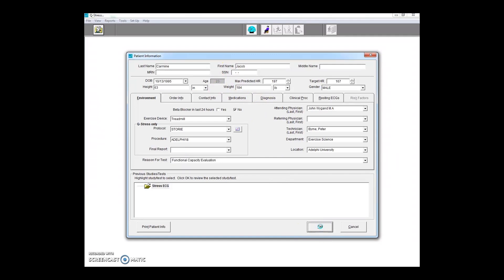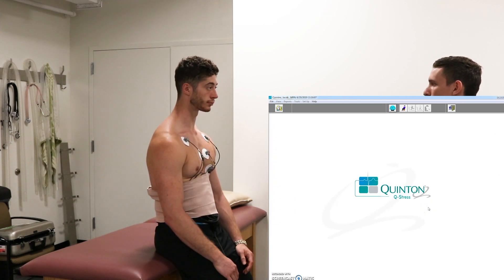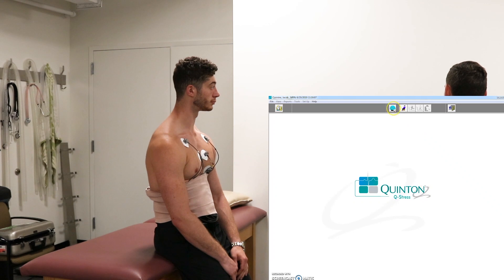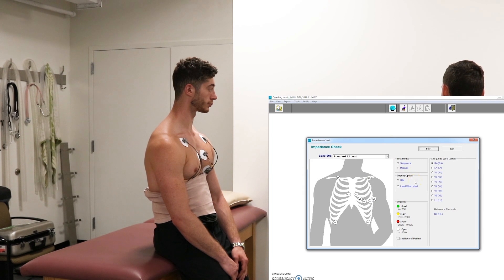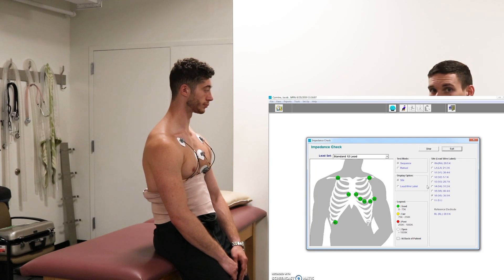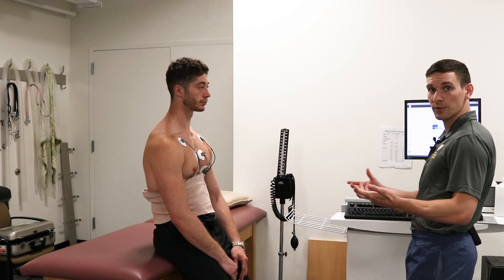We come back to our subject, have them lean up against the bed and stand normally. We run an impedance check — clicking the button for the person standing with all the electrodes on. If we did a proper prep and placement, all leads should come up green. We hit Start, wait for all of them to pop up — and they're all green, meaning everything's been placed well. We can hit Exit and get ready to perform our test.